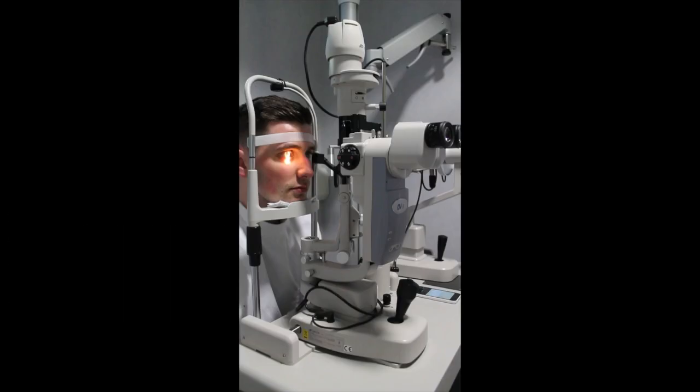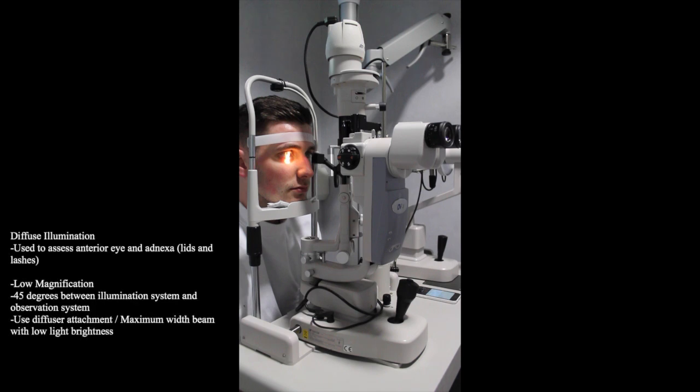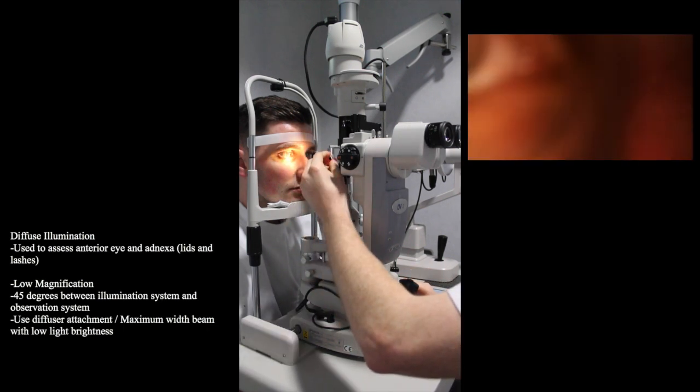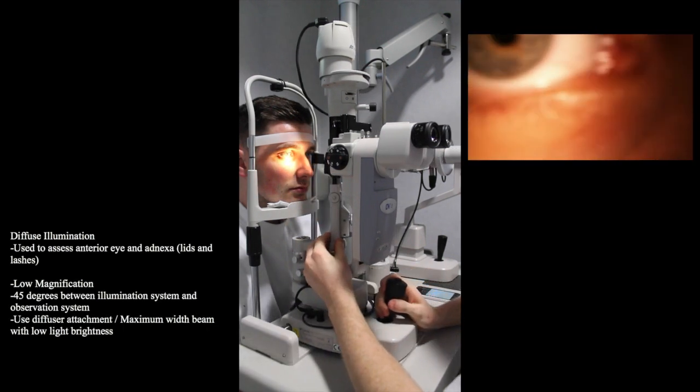Usually the first method used will be diffuse illumination. This allows us to gain an overall view of the anterior eye, including the lids and lashes. Most slit lamps will have a diffuser which can be placed over the mirror, allowing us to see the eye over an even illumination.